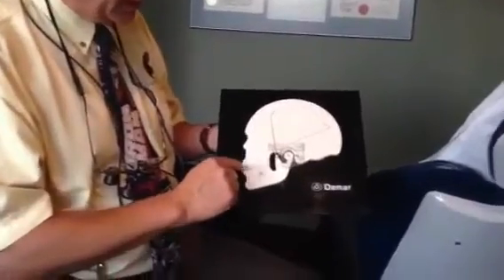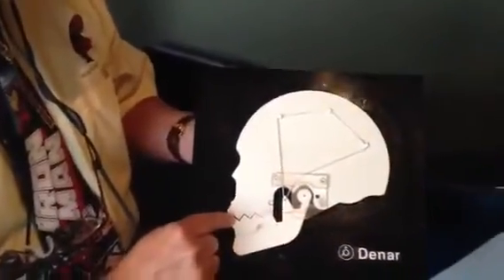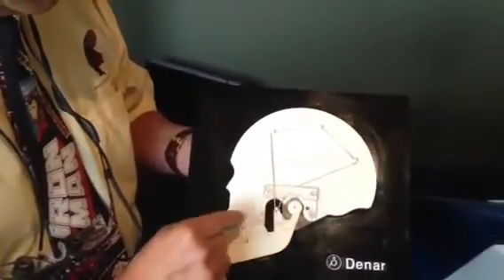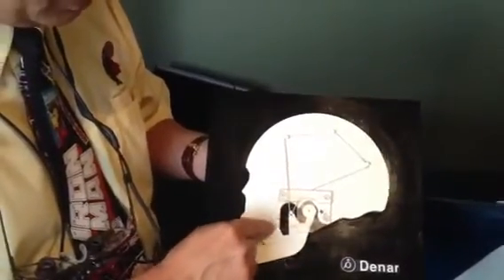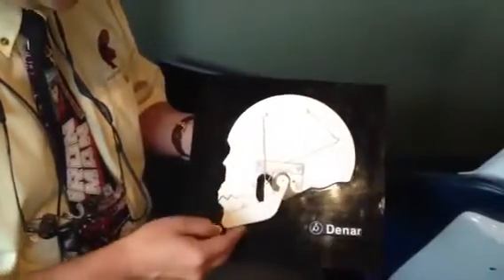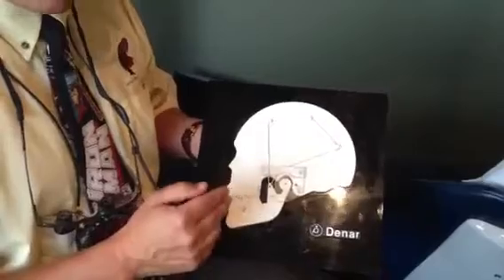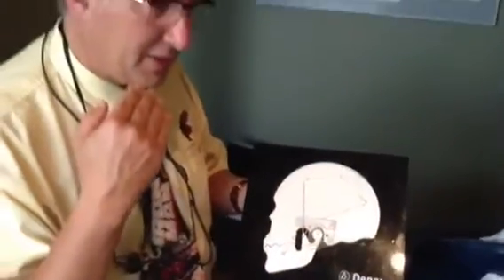And the best way of thinking of it, it's a clear piece of plastic. It fills the space where the teeth don't fit when the jaw's in the right position. And a good way to think of it is that it's an artificial bite. It interposes plastic in between the teeth. Now you break up that neuromuscular reflex and the jaw muscles start to relax. Now the bite changes when that happens, so you have to adjust it. And then it relaxes a little bit more, you adjust, relax a little bit more, you adjust.